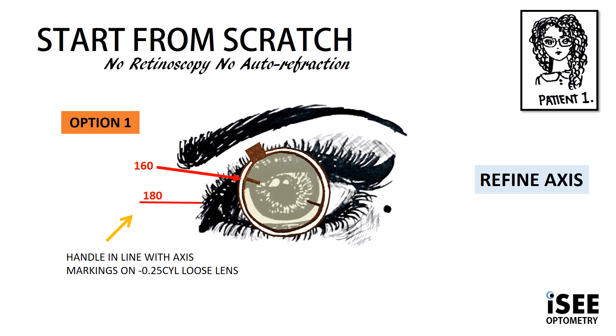Emily decides she likes option one. So we move our loose lens in the direction of the red markings — hence we follow the red, which is the minus. We're going to move our minus 0.25 loose lens cylinder 20 degrees away from the 180, so that takes us to 160.